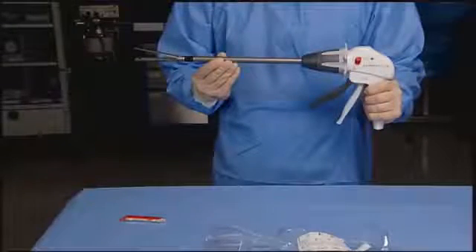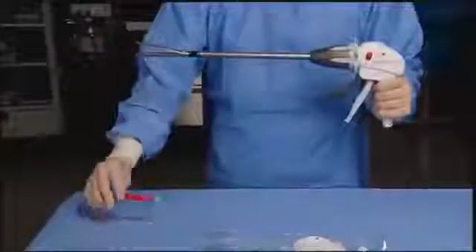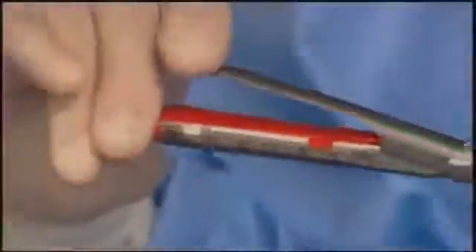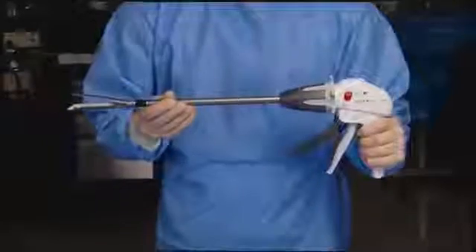Examine the reload for the presence of a staple retaining cap. If the retaining cap is not in place, discard the reload. Insert the new reload by sliding it against the bottom of the cartridge jaw until the cartridge alignment tab stops in the reload alignment slot. Snap the reload securely in place. Remove the staple retaining cap and discard. The instrument is now loaded and ready for use.